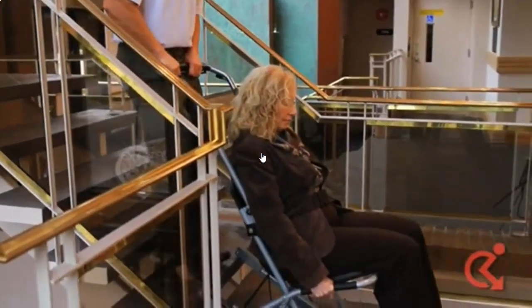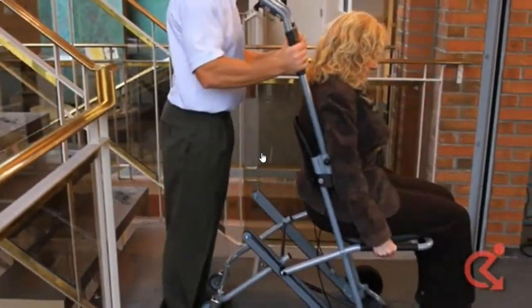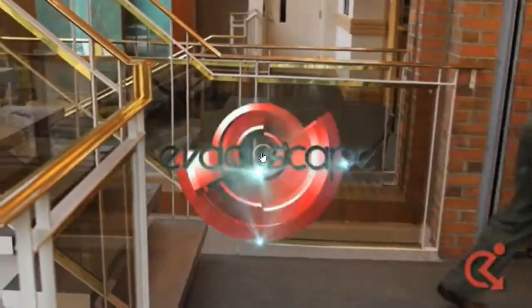When the Evacuscape chair reaches the bottom of the stairs, pull out the rear wheels to convert the Evacuscape chair back to transit mode and proceed to the next stairway or exit.